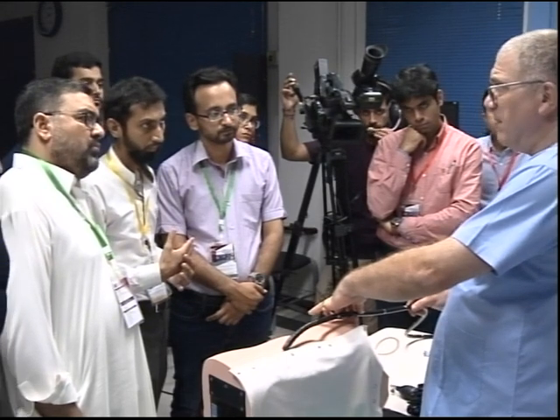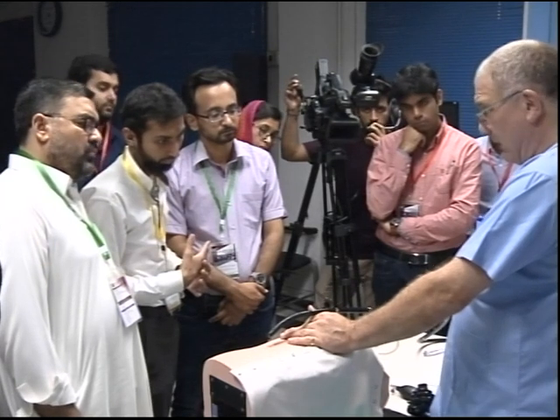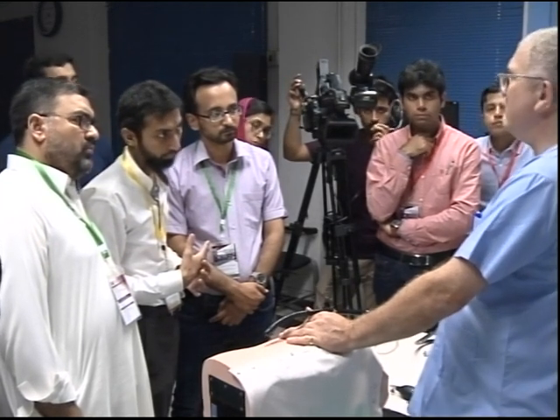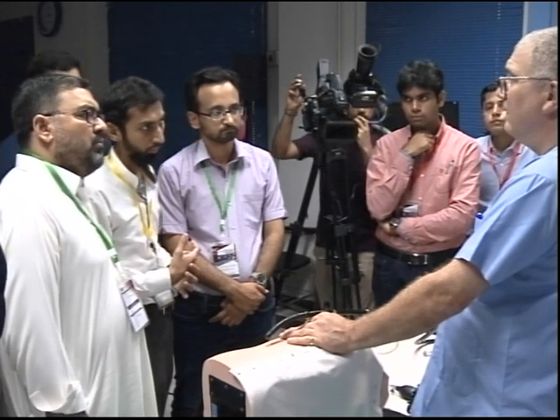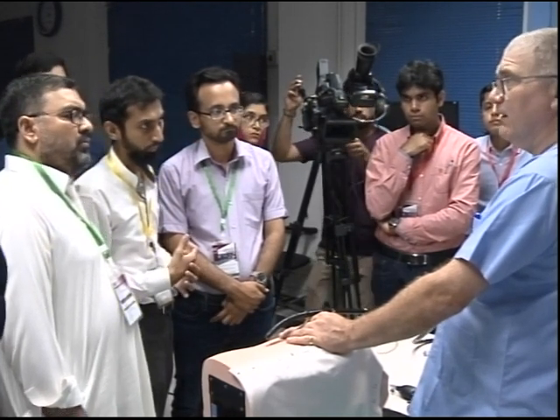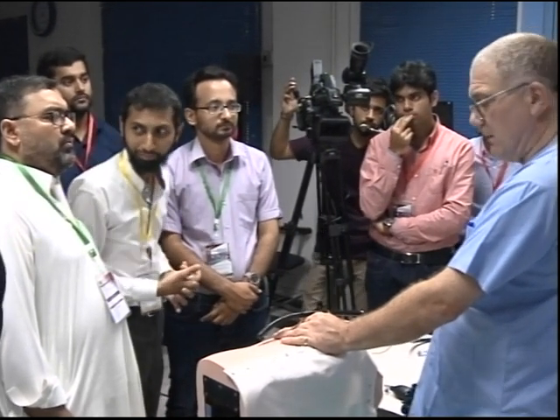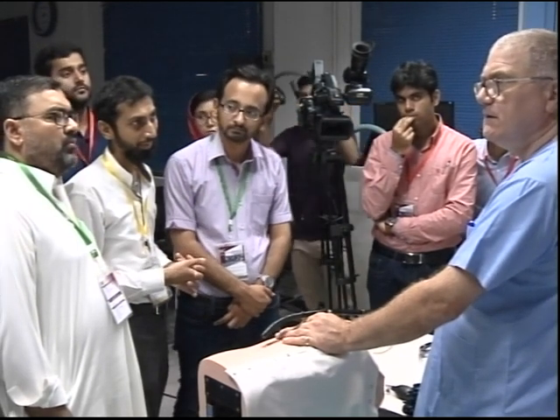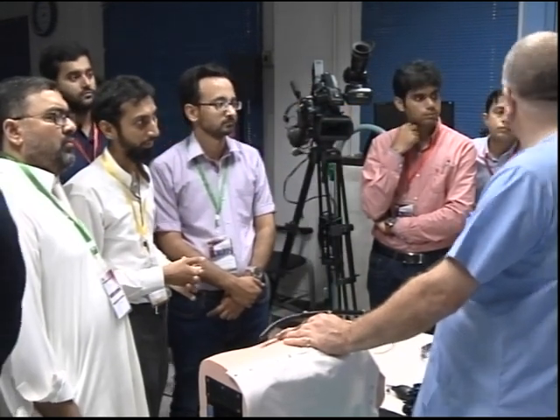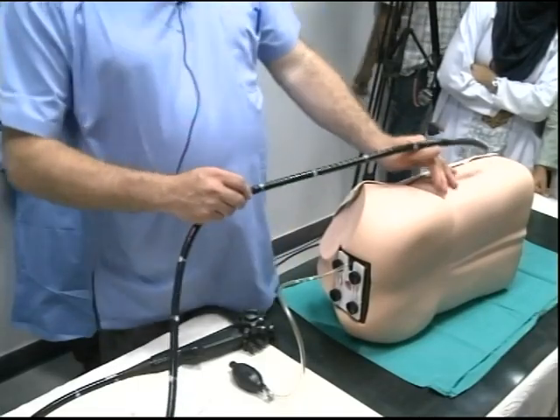And it does make it a little bit more difficult, because if we've got the scope here, and we're going in a straight line. How many of you do rigid sigmoidoscopy? Rigid siggy. Rigid? No? Yeah, but in clinic, do you do rigids? I did it twice. Only done it twice. Okay, right.